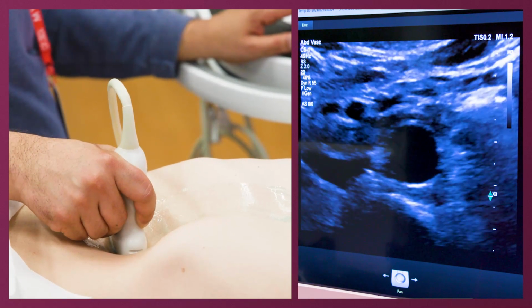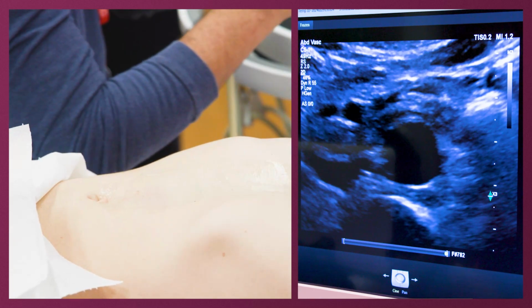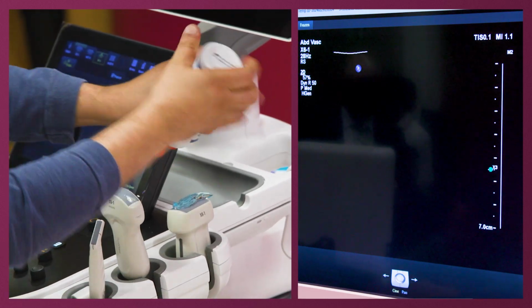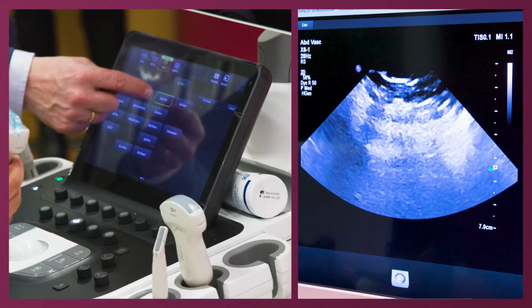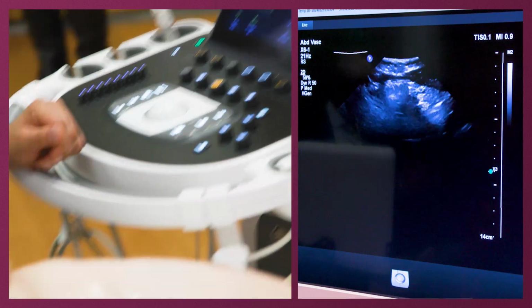So that's why you should use ultrasound, because here you can control it. It's going to be a mix of systole and diastole, probably on a CT scanner. Now we can try this. You push this one, and there are several possibilities. It's important to take abdominal vascular.